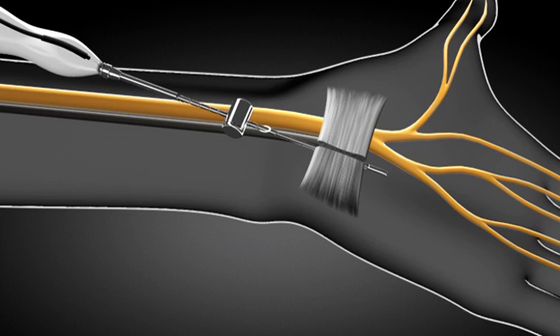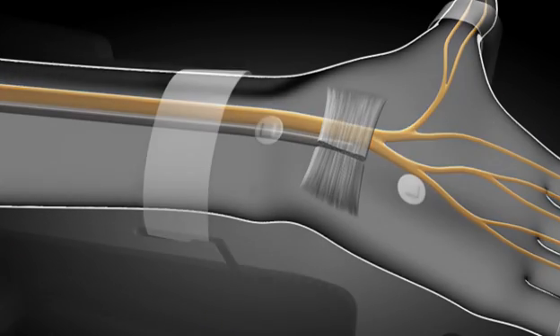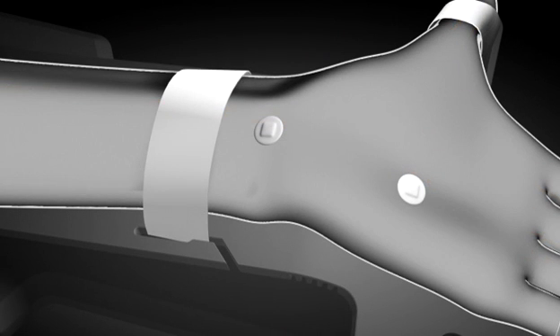The carpal tunnel release blade assembly can then be removed from the hand through the access cannula, and the access cannula can be removed as well.